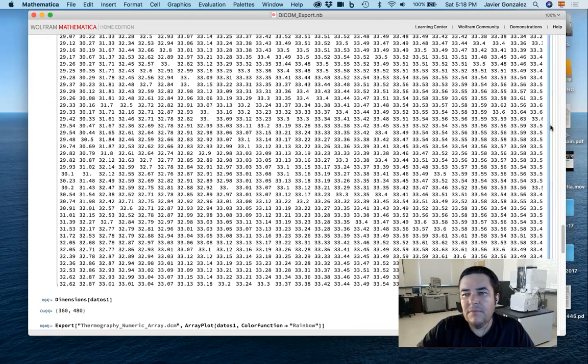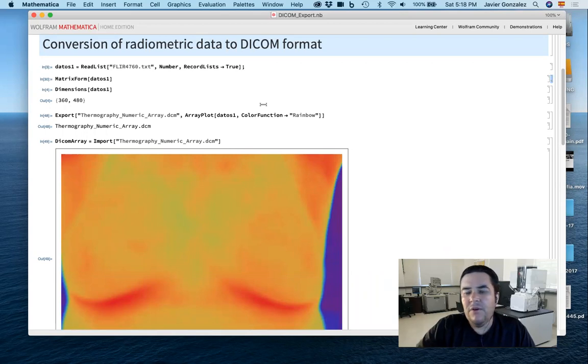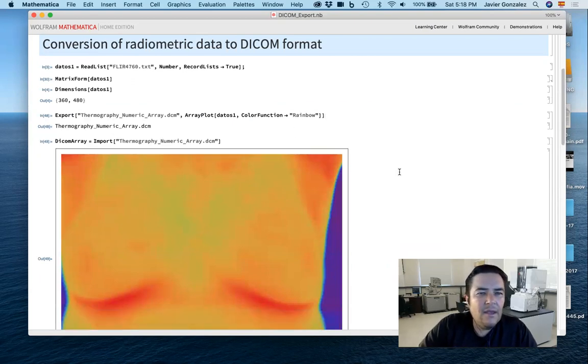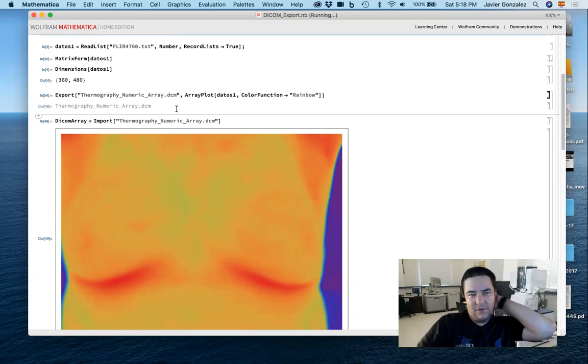I don't know if that's the units FLIR uses. I think it does. Or there's a parameter you can put in the software development kit, so you can do it in degrees C. So that matrix is 360 by 480 pixels. Each one is a temperature, and I exported that numeric array into a DICOM file. That's called thermography numeric array.dcm. So there it is.